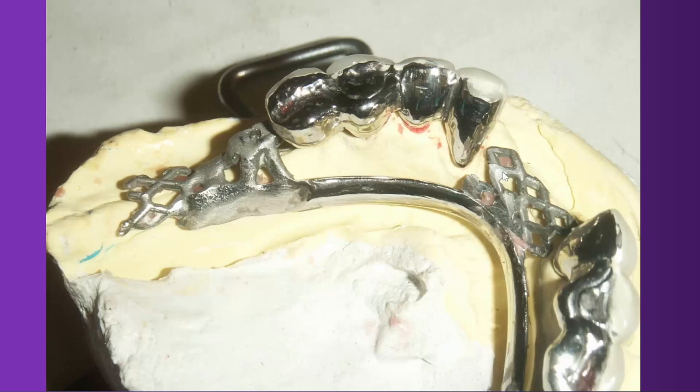That's how they fit. It's fitting well. It's not that easy to get this, especially if it is cobalt chromium. Yeah, with gold it would have been way easier. This is the master model. We come back on the master model and we will glue the two components to the main connector.